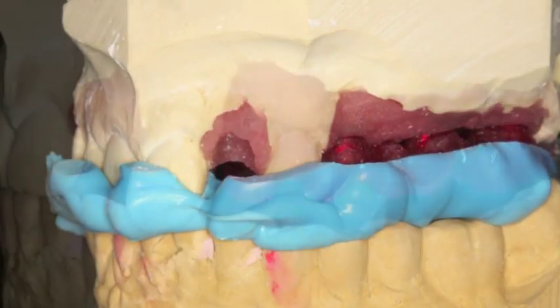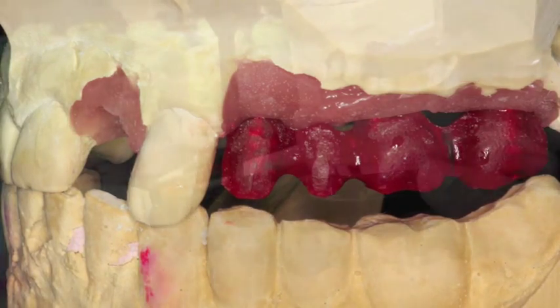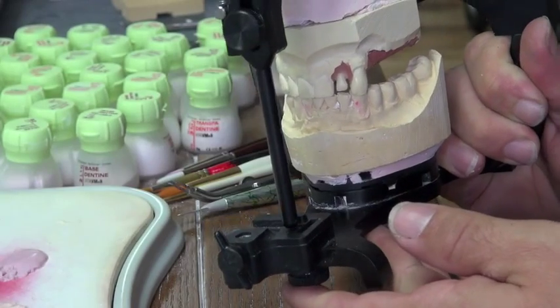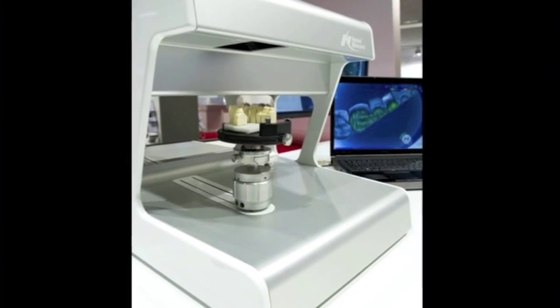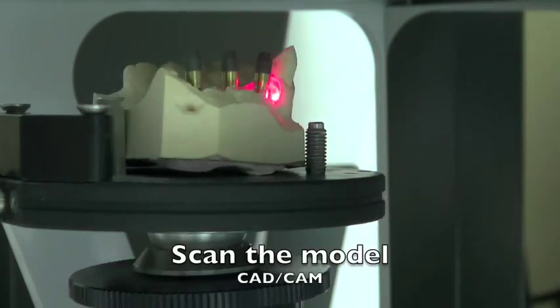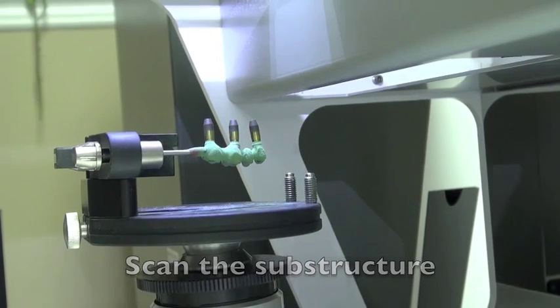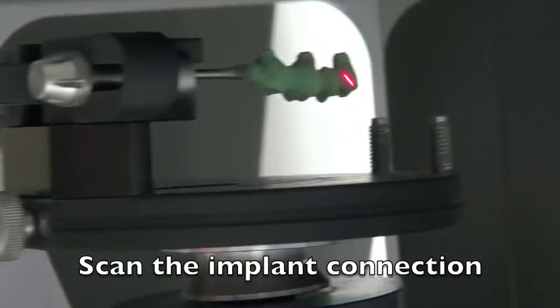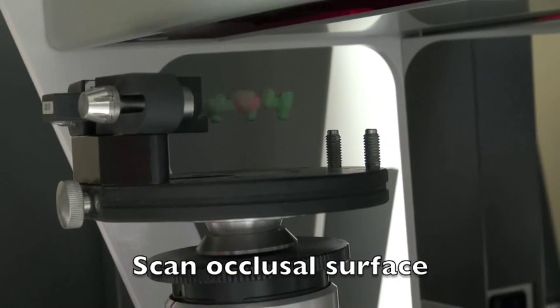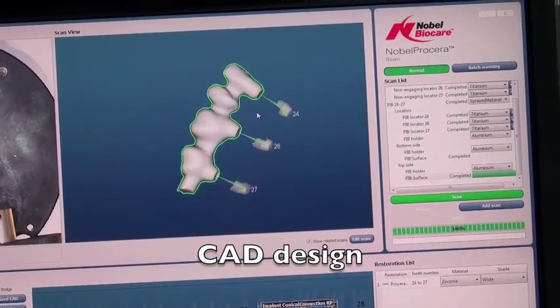We'll mount our model on the articulator with a face bow to get a good record. We need to add some Duralay to the guide for the substructure so that the porcelain won't be too thick when added. Once the model is mounted, we take it to the CAD/CAM scanner to get the model designed, scanned, and milled. We scan the substructure by putting pins on, then scan the back, top, and sides. For the occlusal surface, we've opaqued it out with green paste so the computer can see it clearly.